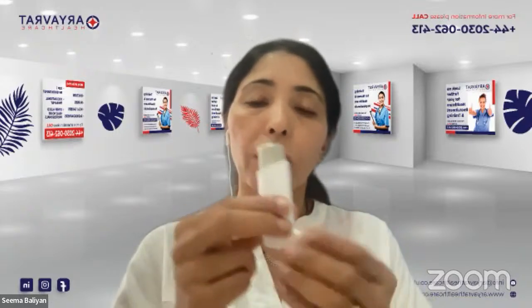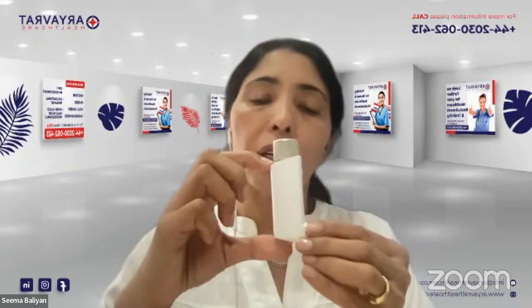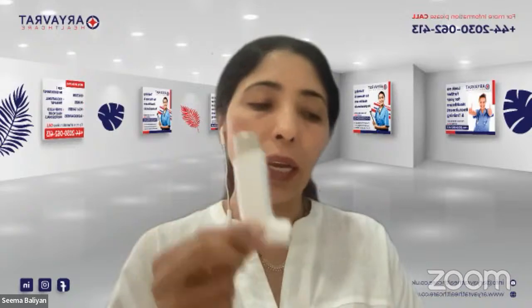So now these are all of your parts. The mouthpiece, the body, and inside the body there is a canister. So these are the parts of your inhaler.